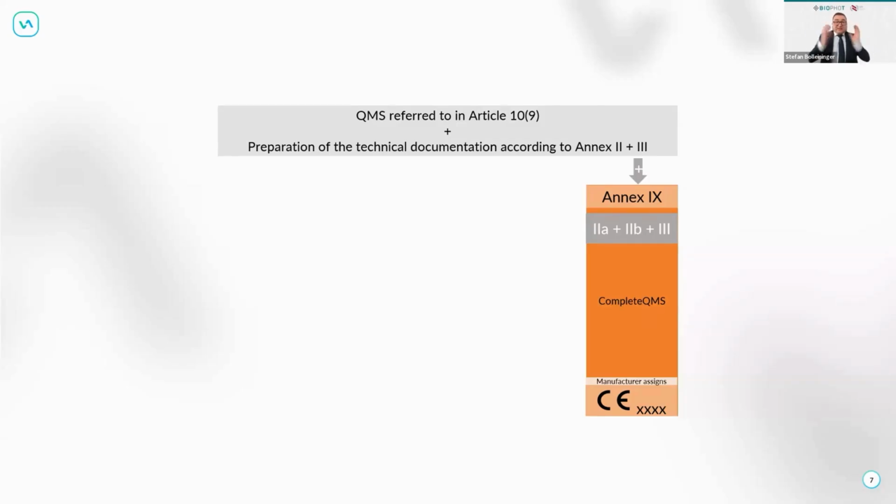So, there are a few concepts in there, which is a very interesting question. There are imaging devices which are Class 1. There is imaging software which is Class 1, and there are also physical imaging devices like ECG visualization, which is a Class 1 device. And then, yes, that can be purchased by the doctors, by the physicians in the hospitals. Sometimes there are tender rules which do not allow that. But in general, yes, you can do that. So a Class 1 medical device is a medical device. And then the usage in various use cases.